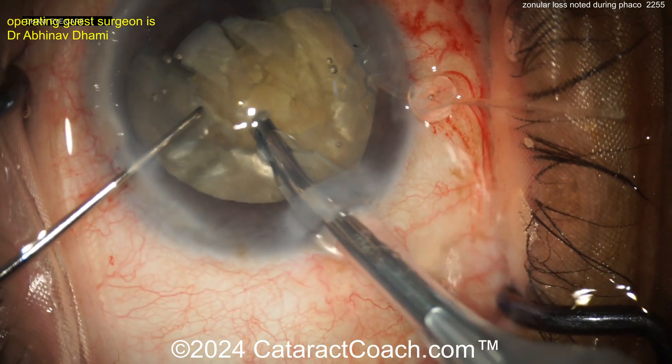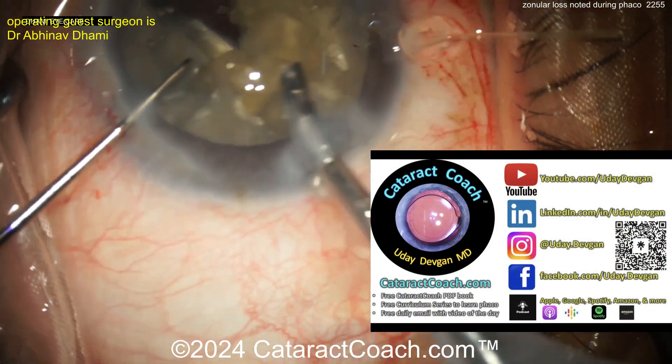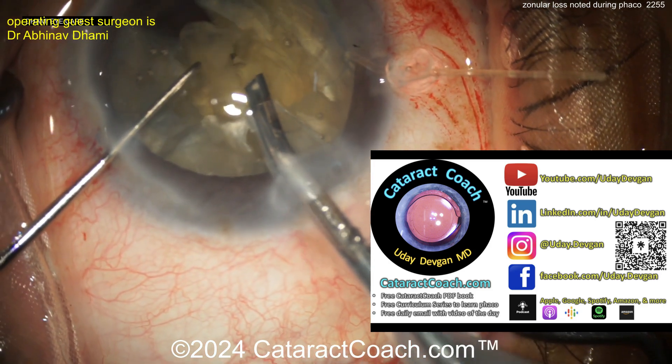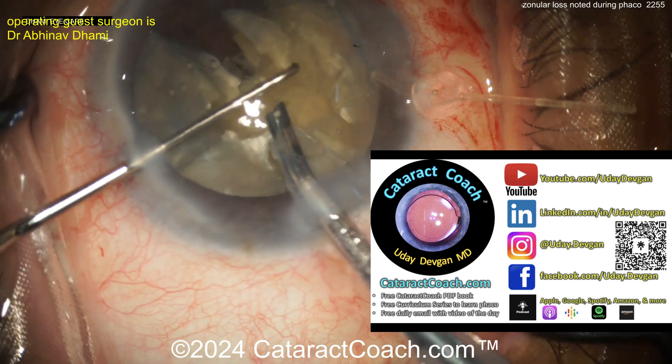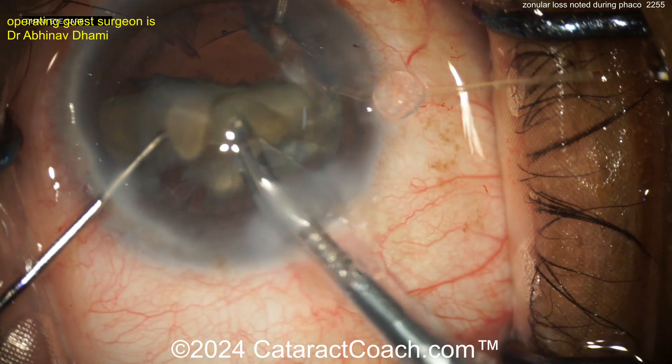Now let's see — we're going to do more chop here, get that nucleus up. Let me tell you about CataractCoach.com, our teaching website — so much more material than you'll find just here on YouTube. If you're a young doctor in training, have you downloaded that free PDF book yet? Have you gone through the free 25-part curriculum series? You want to learn FACO, right? Now back to this case, taking out that lens material.